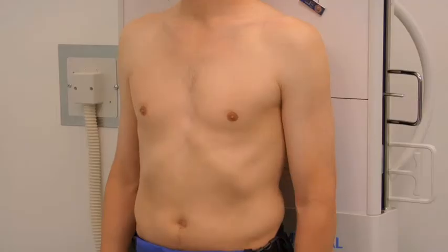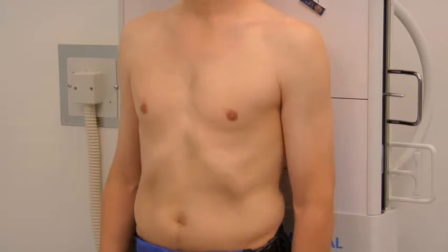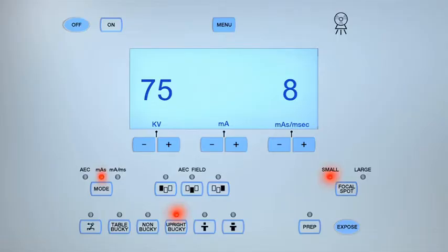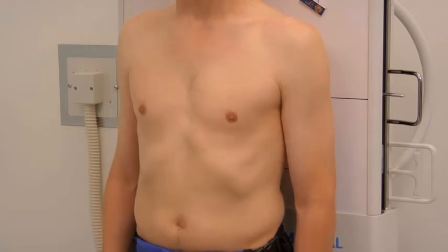Ask the patient to take a deep breath in and out, then take another deep breath in and hold it. Expose the cassette by pressing the prep button, then when ready press the exposure button. Once the exposure is completed, inform the patient that they may relax and breathe normally.